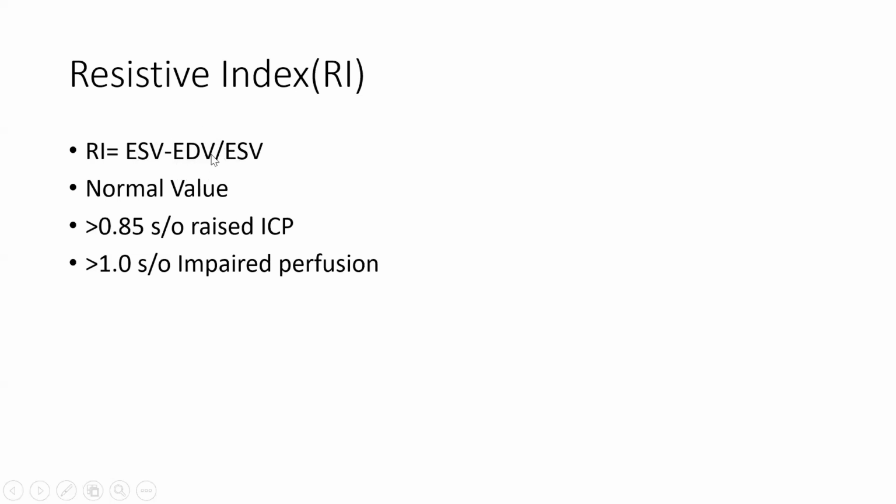This also depends on the PDA. If you have a hemodynamically significant PDA, HSPDA, you are not going to see the diastolic wave. It might be absent, and it's difficult to calculate the RI in that case. But if there is no PDA, and there is an absent diastolic wave, that means your RI is very high. Somebody yesterday asked about the PI, the pulsatility index.